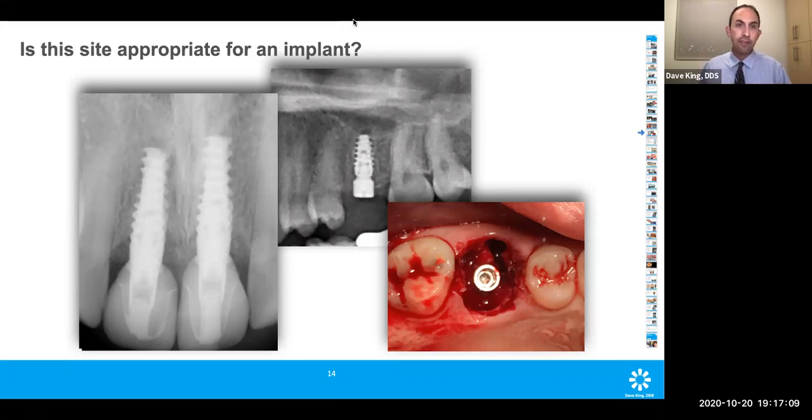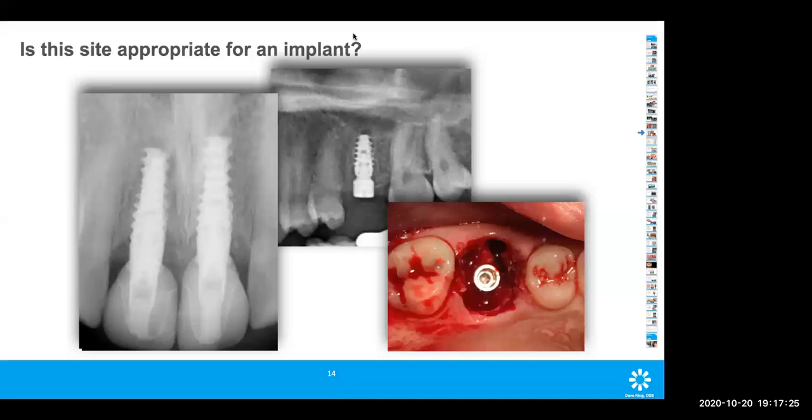So the implant comes up out of the bone, and then you've got a crown that comes straight out and up. That way it yields a much more natural emergence profile coming out of the gums. Otherwise, we'd end up with the other type of shape, and I'll show you some pictures there. But in this case, yeah, go ahead.